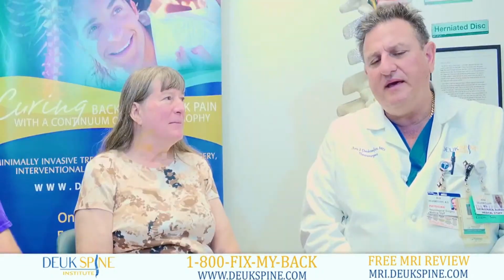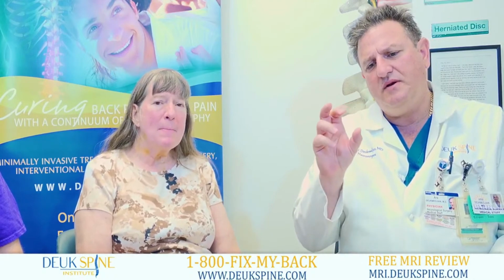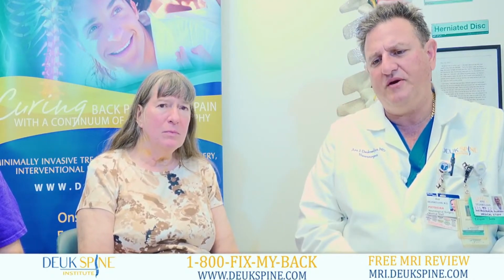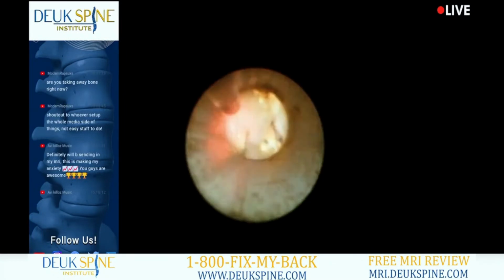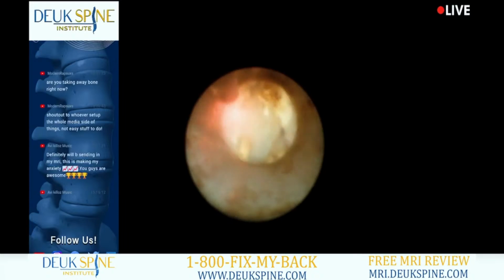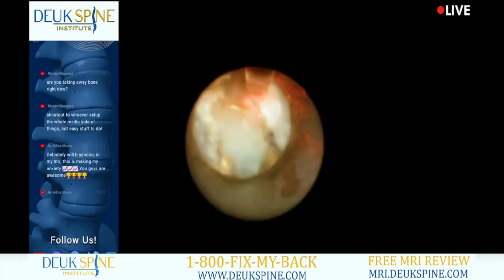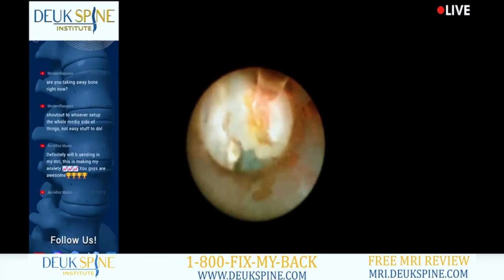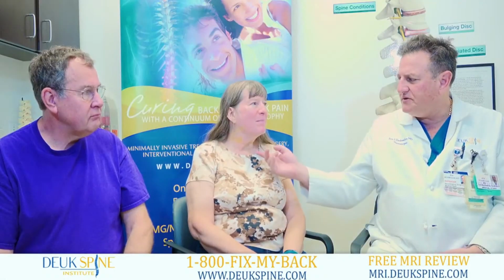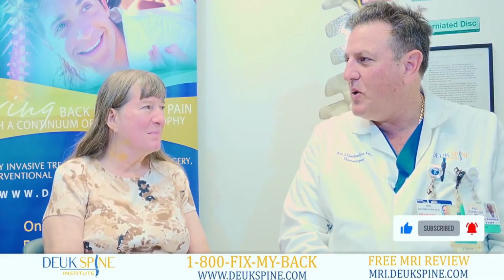You couldn't do that before. Yeah, that's because she had a herniated disc, two of them, C4-5, C5-6, and the herniations were literally sitting on the nerve. And we got in there, and if you watch this video segment right here, you can actually see there's the laser, and as we're removing the herniation, it literally pops right out of the foramen where it was sitting on top of the nerve, crushing the nerve. So, the surgery was a success. We lost almost no blood at all, and you can see your incision is tiny, and here you are one day after surgery. It was outpatient, and you're ready to go home, right?